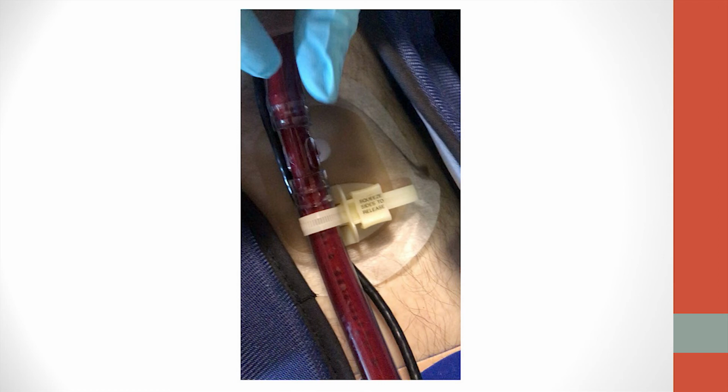So this was a recording from bedside device interrogation. Obviously, permission for reproduction of this video was obtained from the family, and care was taken to omit all patient identifiers. And this is video courtesy of one of my attendings, Dr. Bindo Akanti. As you can see here, I don't know if you can see it very well, but you can see a lot of air bubbles going through the system. And this is obviously a closed-loop system, and this is coming from the 21 French inflow cannula.